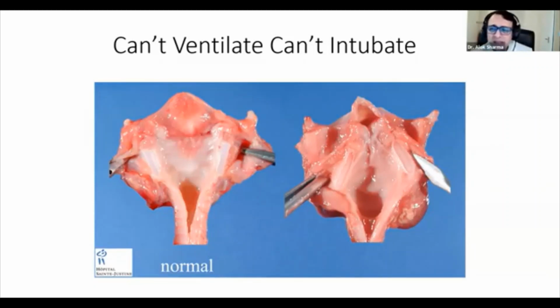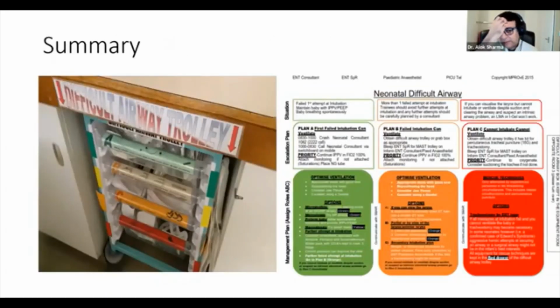So I would always say that if you are unable to intubate in your first attempt, go and default back to what was working and moving that chest. Think about why you failed, what you're going to change about your next attempt. But having more than 2 attempts by the same person risks repeated unsuccessful attempts, which actually puts the baby at risk of glottic edema. And then even very experienced people will not be able to manage that baby.